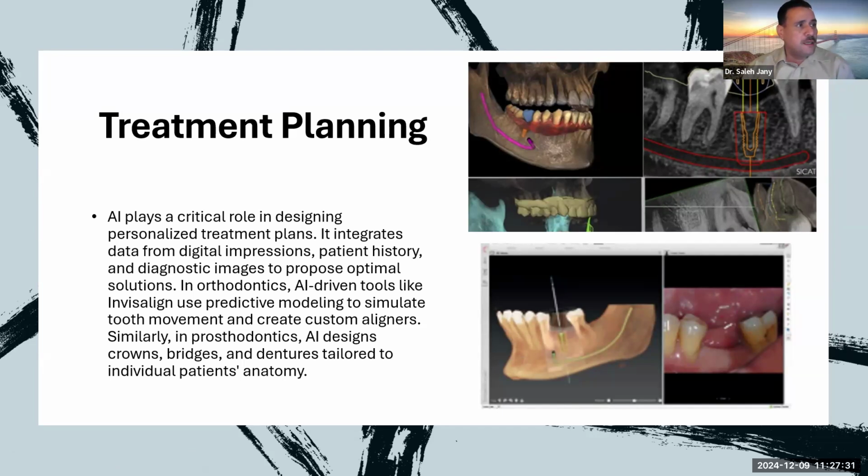So this is the 3D X-ray. A 3D X-ray will show you the bone, the nerve. It shows you the teeth, the occlusion, the bite, how much bone loss, and where the vital structures are. And when we do implants, we have limitations.